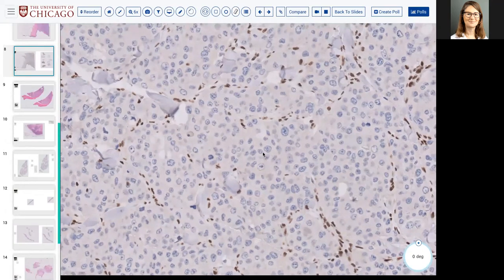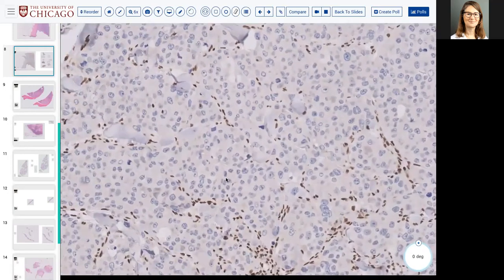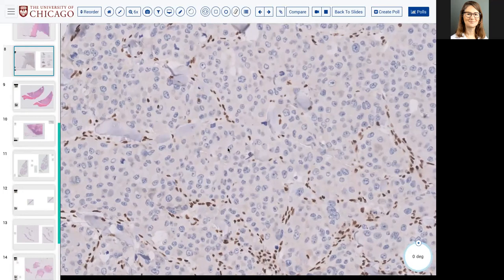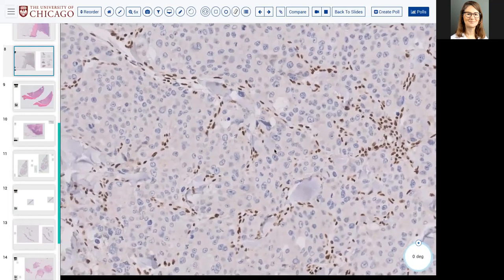I don't know, but is this a carcinoma or is this a sarcoma? And so generally the thought is, if this arises in a visceral site like a lung, there are these chromatin remodeling INI BRG lost carcinomas. Okay, but if this arises in a soft tissue site that is not a visceral organ or not epithelial organ related, then it's considered a sarcoma. And this is completely sort of semantics about where it originates. Generally, these are always bad. Like these are just bad tumors. And so what kind of treatment these patients get may or may not actually affect them. But generally, if it's in a soft tissue sarcoma type of site, it's a sarcoma epithelioid.